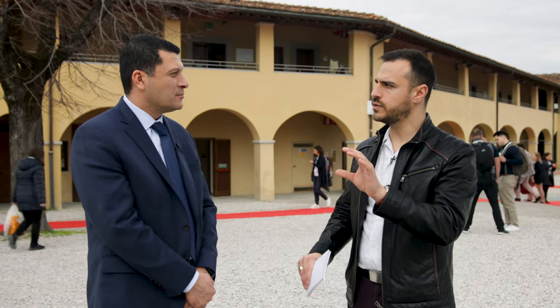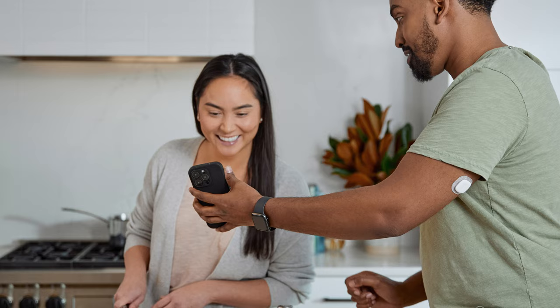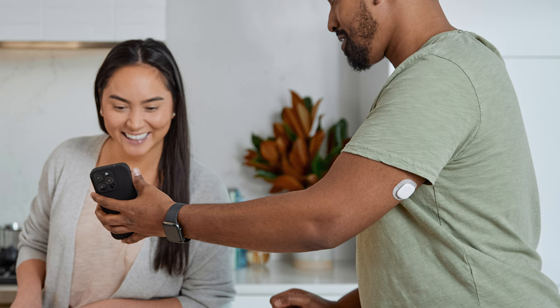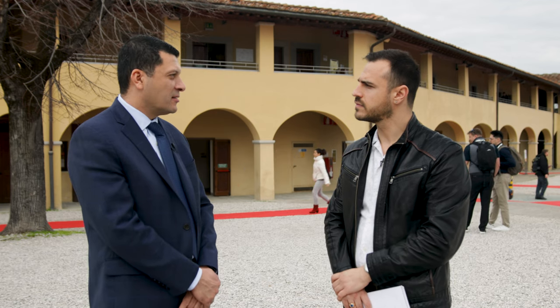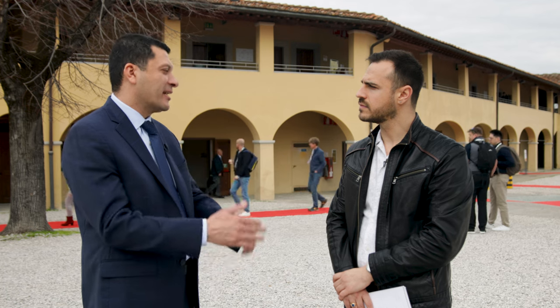The sensor is approved for the back of the arm for adults, with some other locations available for kids. All manufacturers have learned over time that you get the best performance on the back of the arm, which is why they're all aligning to that location.